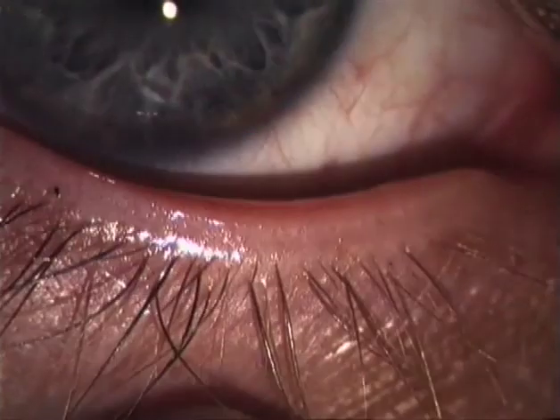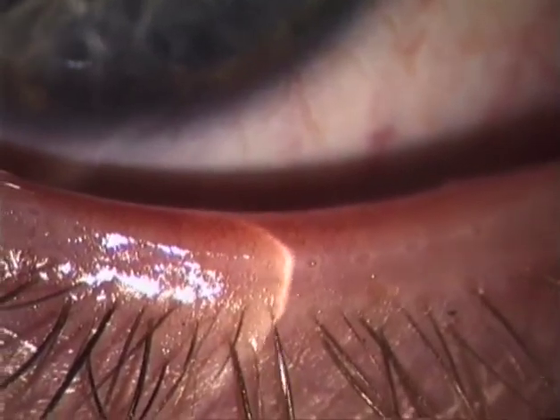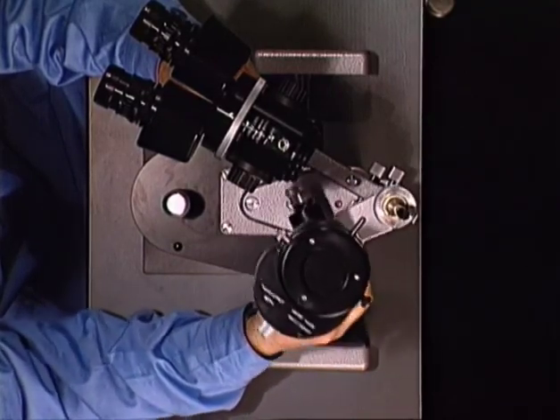This mucocutaneous border can be made visible in specular reflection. For this purpose, either the lid margin is shifted until the reflex at the tissue surface appears, or the incidence of the light beam, that is, the angle of illumination, is varied until the specular reflex can be made out.